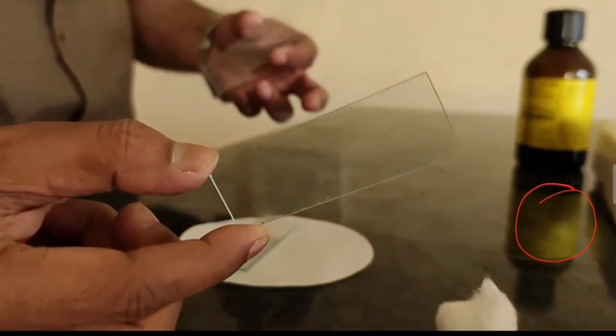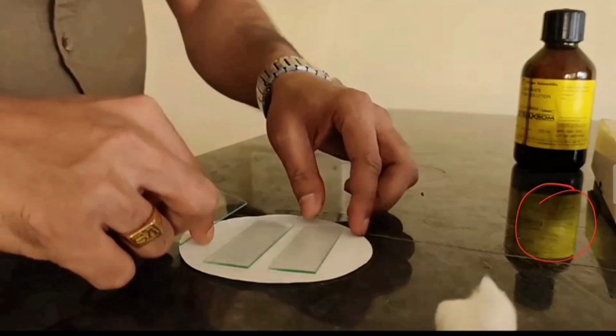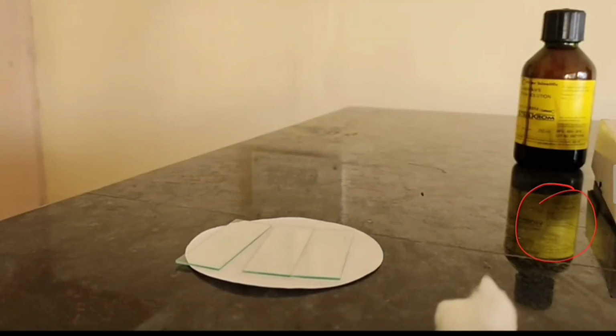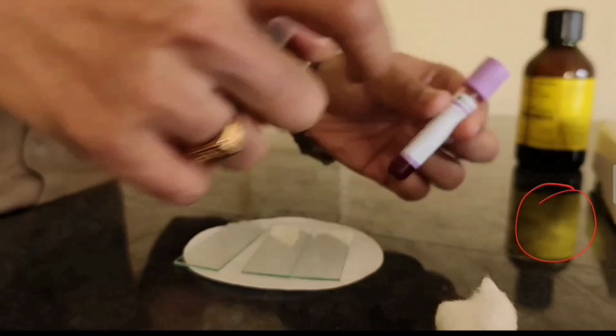This is another glass slide, and always touch it from the side and not on the surface. Like this you should always touch, because if you touch the surface, the mark from your fingertip will stick on the glass slide, and again there will be a chance of vacuoles on the blood film.